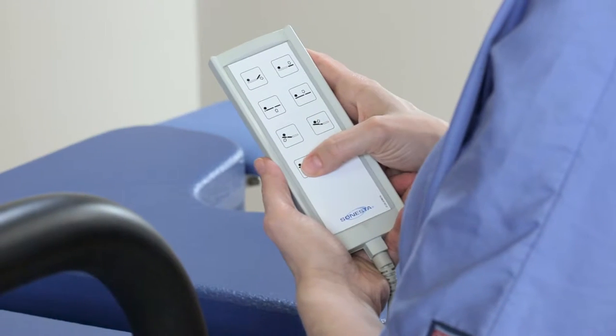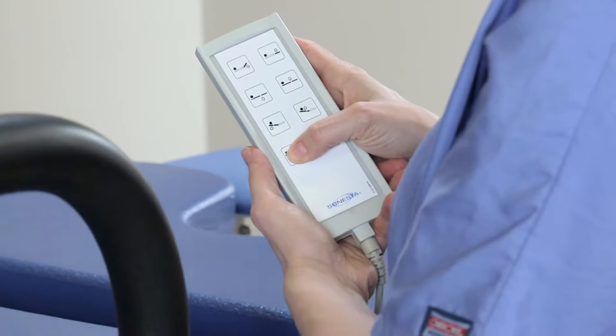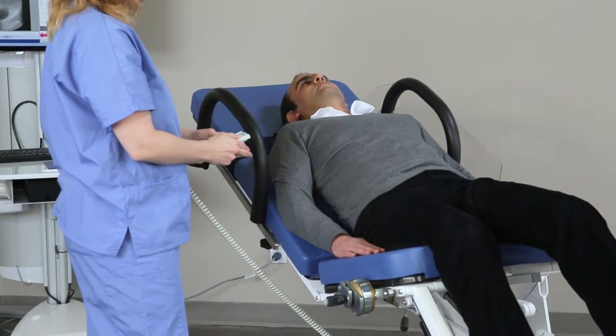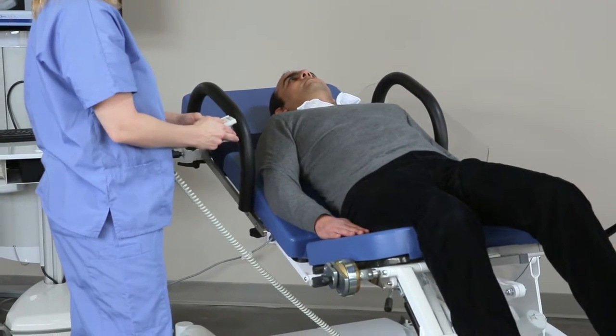The last pair changes the angle of the whole table, moving the head end up and down. Two buttons can be used simultaneously to maneuver the patient.